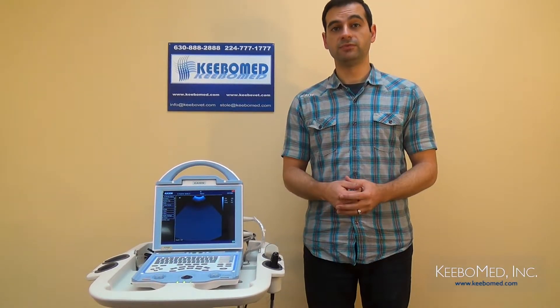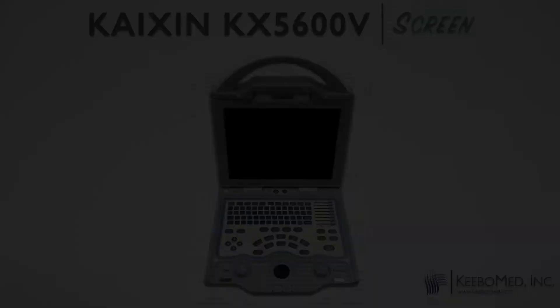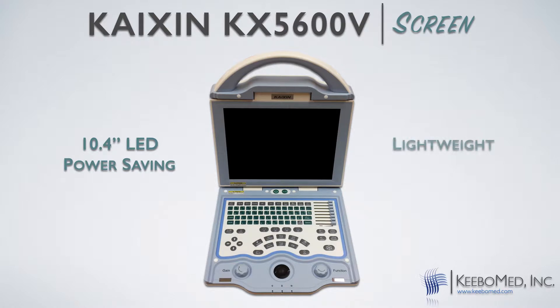Let's consider some of the advantages of the screen on the KX5600. The screen size is 10.4 inches, and it is an LED screen, which is power saving, lighter in weight, and produces clearer images. This is certainly an advantage over ultrasounds that are LCD or CRT.